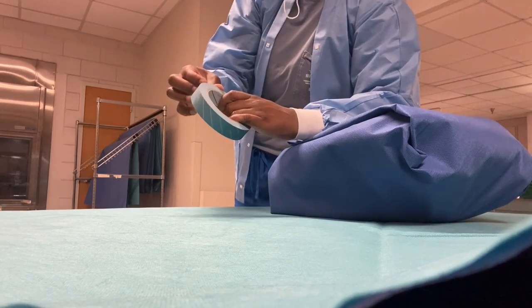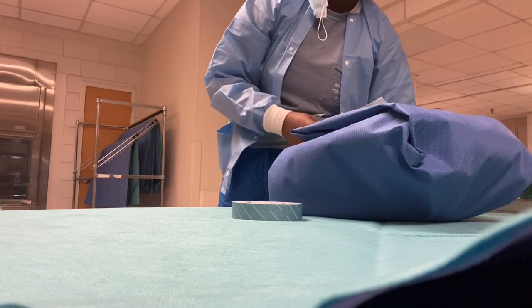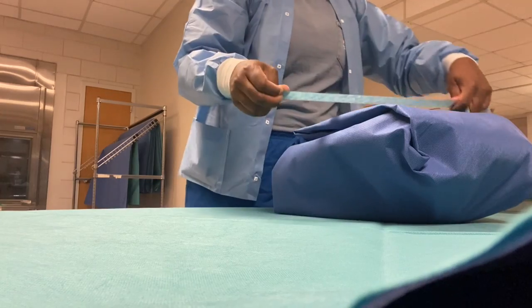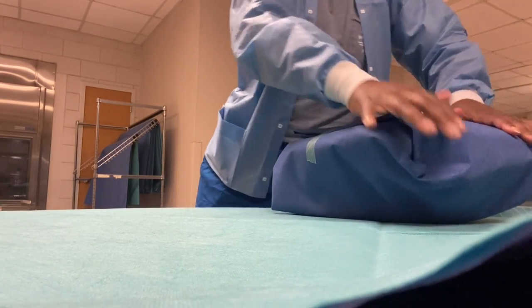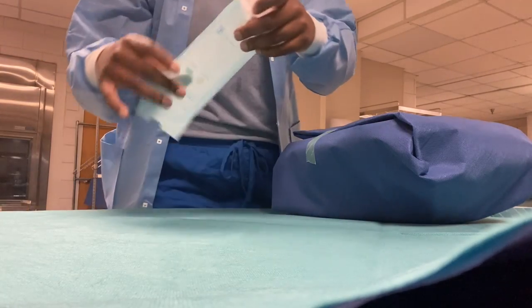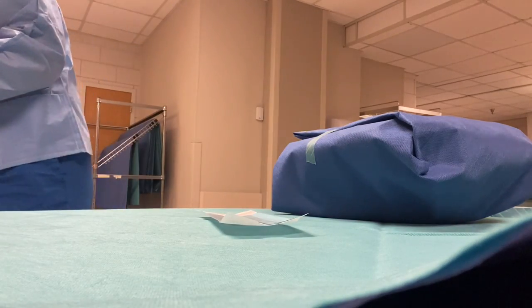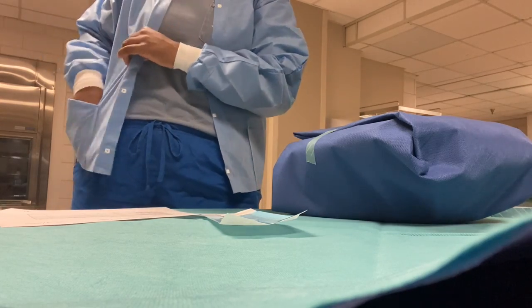To secure it, I'm gonna take it a little different today. We put our count sheet paper inside of this. So first I have to fill it out. Or finish filling it out.